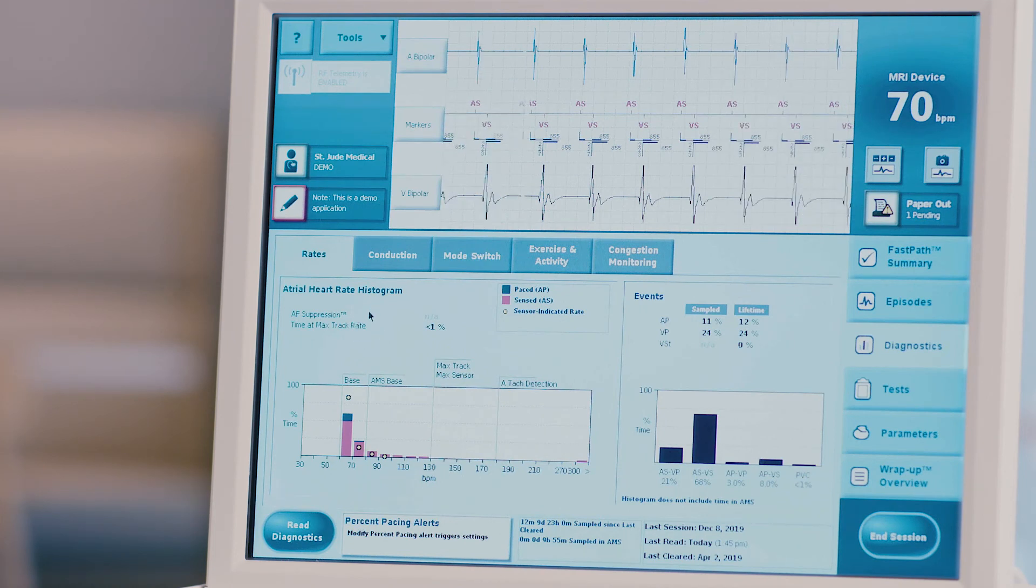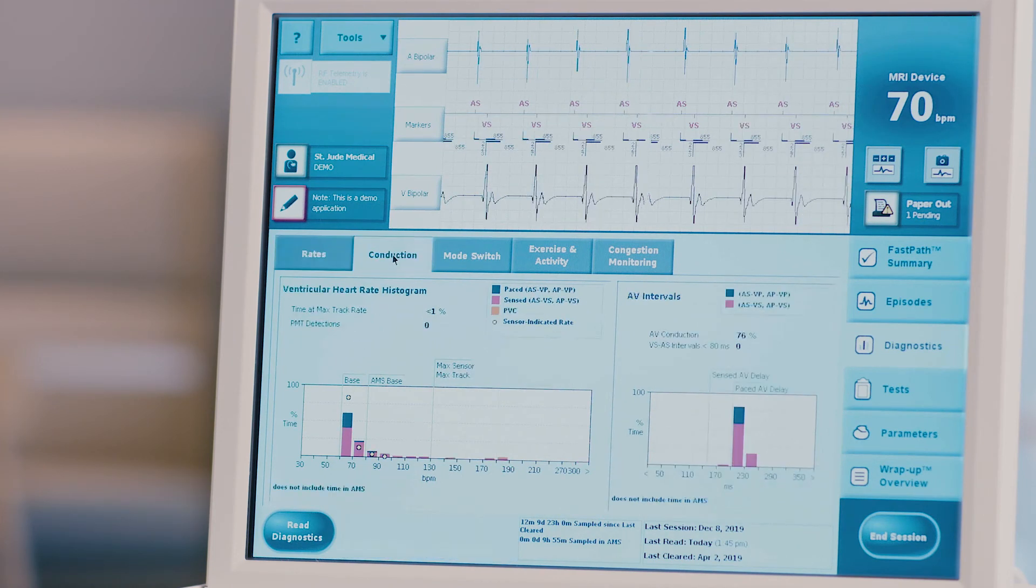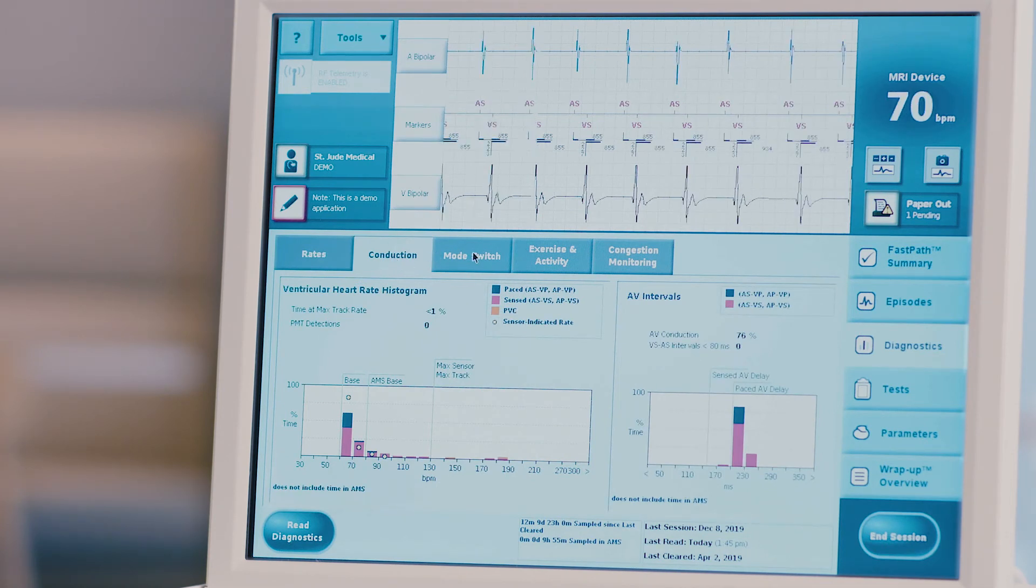Press the conduction tab at the top of the screen. Evaluate the ventricular heart rate histogram. Press the mode switch tab at the top of the screen.